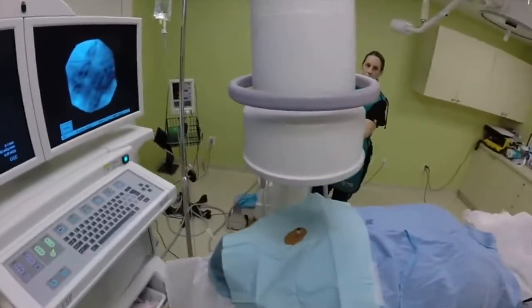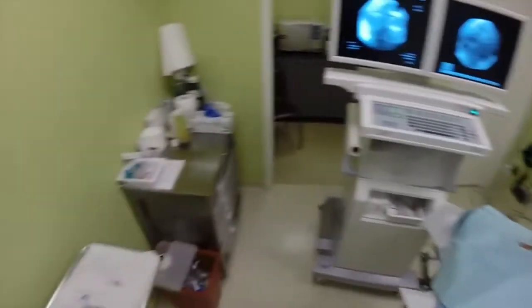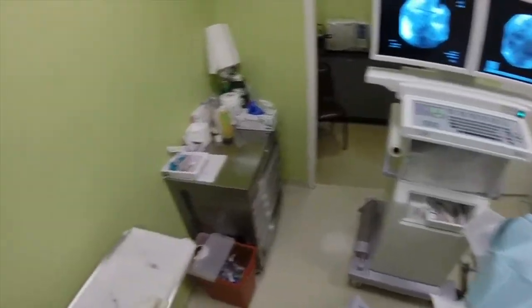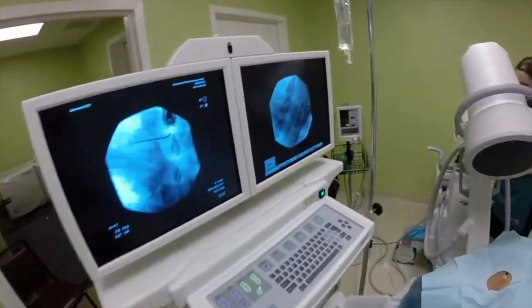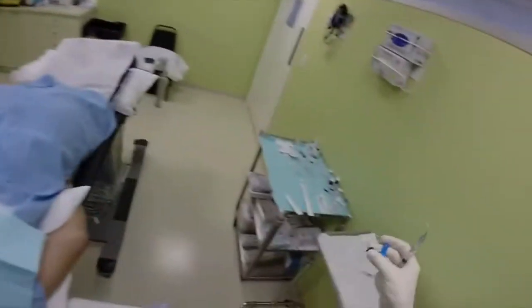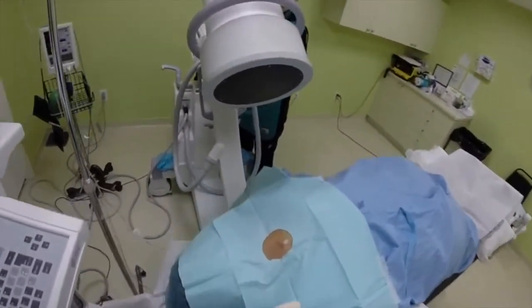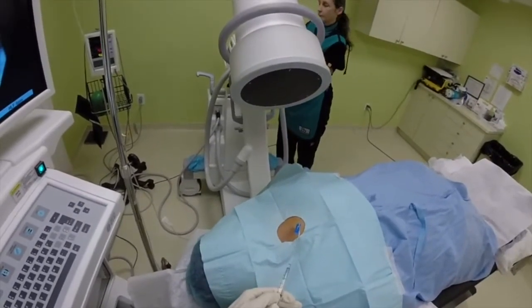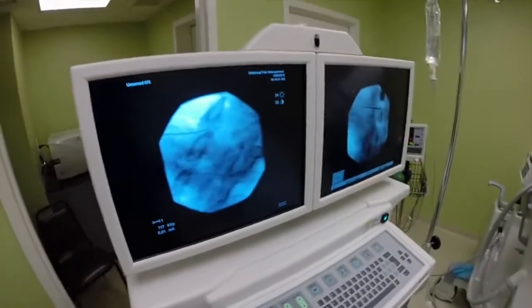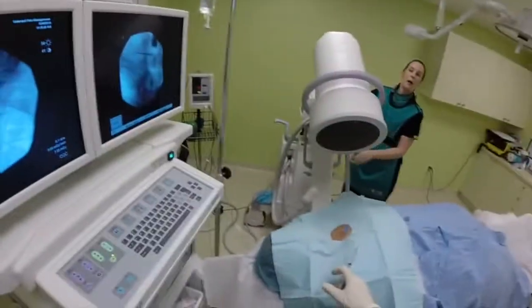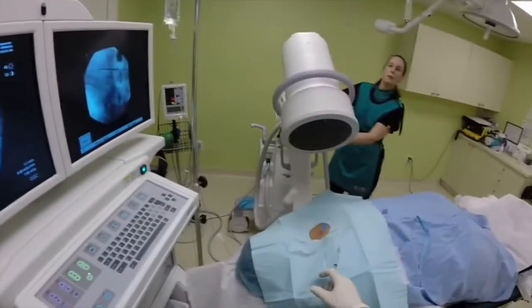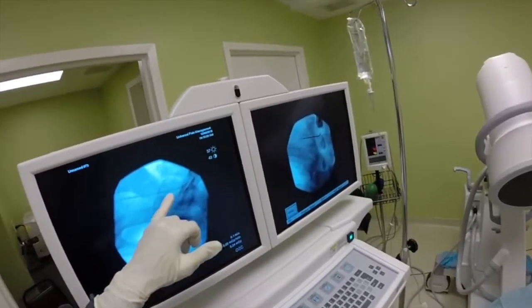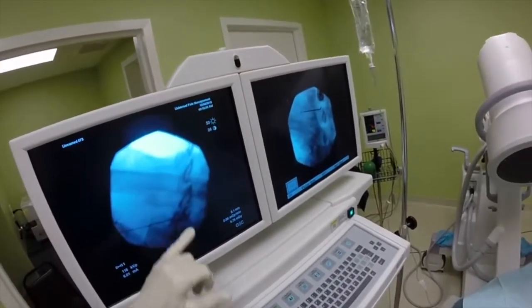Let's go back for contralateral oblique view. Now I'm going to use contrast. We usually oblique the image intensifier 50 to 55 degrees. I will inject some contrast and I will see the spread. You can see my needle and you can see the spread — it's away from the epidural space, it's in the soft tissues.